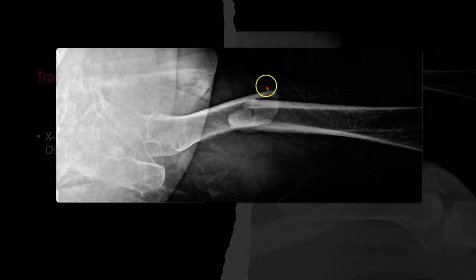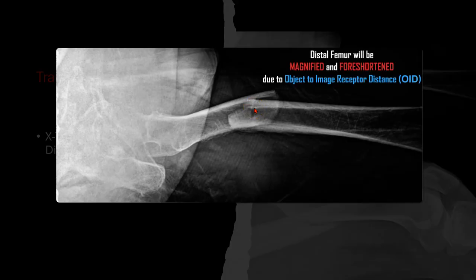Now you can see here we have a bad trauma. Okay, we have a big break, middle of the femur. Not going to be moving this patient a lot, but we're going to do what we can on the femur, just like a shoot through hip, to get the opposite leg up out of the way. We're going to get as much of this femur as we can on this picture, kind of get this end of the acetabulum up towards the edge of our image receptor here.